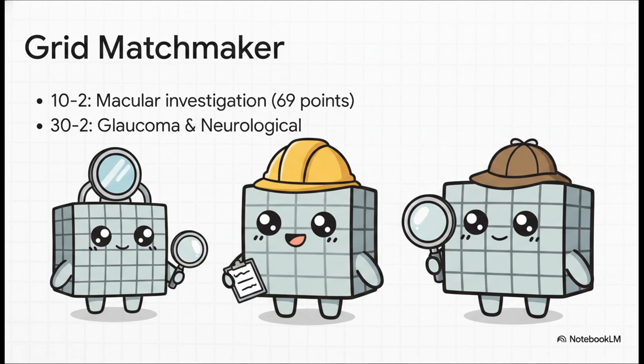But what if you are investigating a purely macular pathology like Plaquenil toxicity? Well, that's when you call in the 10-2. Just remember this clinical tip. The 10-2 is your central vision specialist. It has 69 points packed tightly together just 2 degrees apart. The 24-2 is your absolute daily clinic workhorse, and the 30-2 is your wider field investigator.